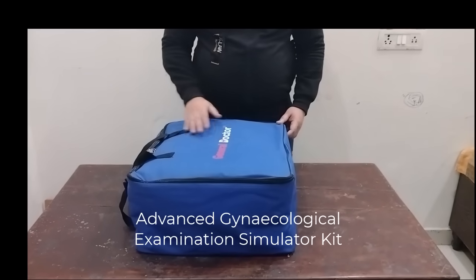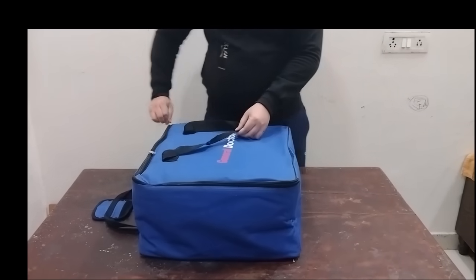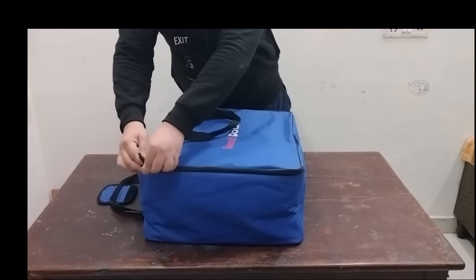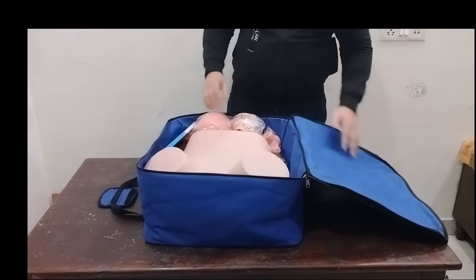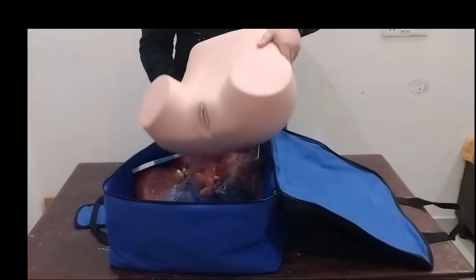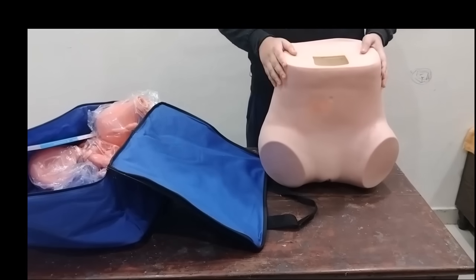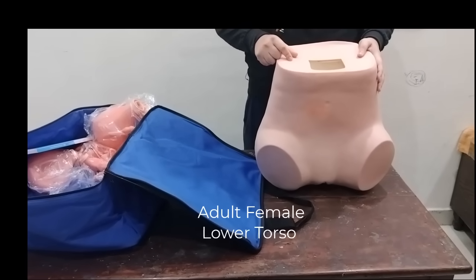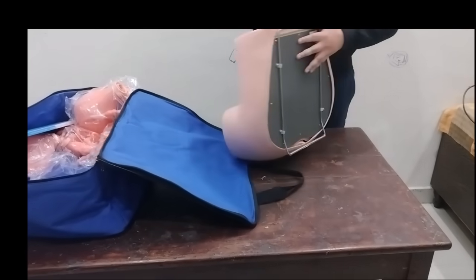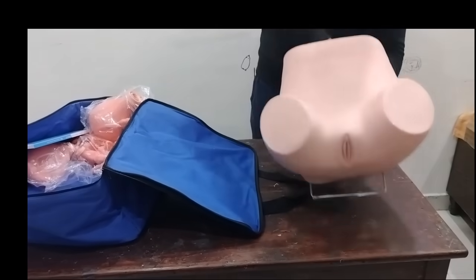So it comes with this casing. Let's open it. This is the main part — an adult female lower torso. It has a stand. You just need to pull it like this and you can place it.